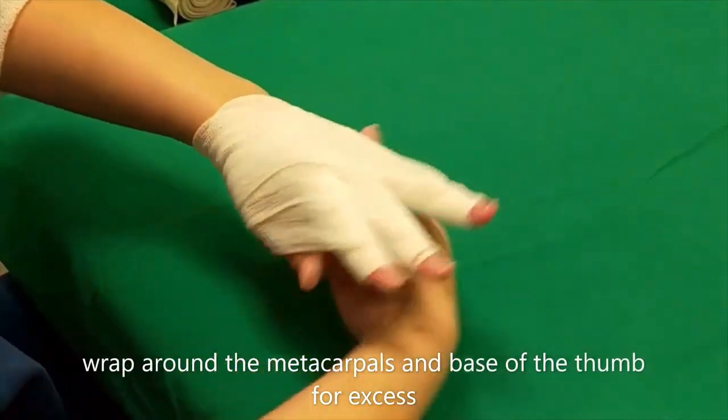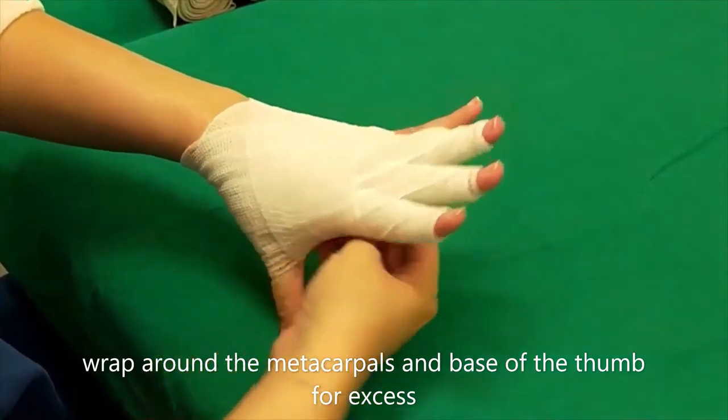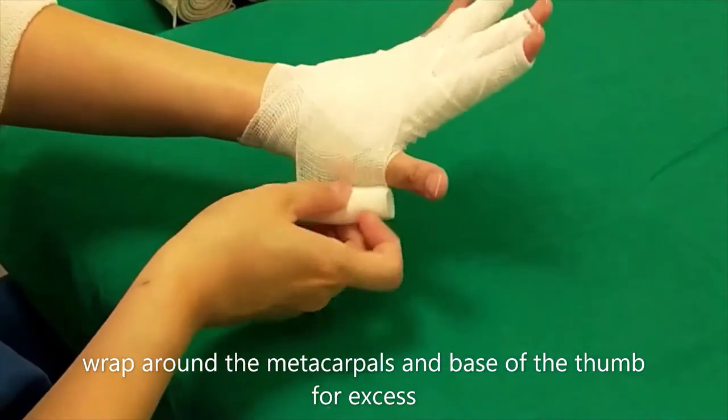Make sure to keep the finger bandage flat. If there is any excess, wrap around the metacarpals and base of the thumb, and avoid pressure over the wound.